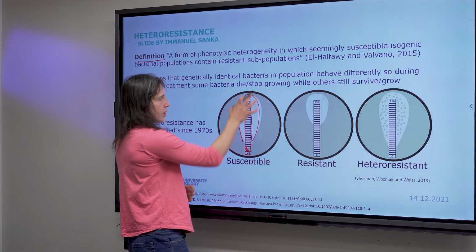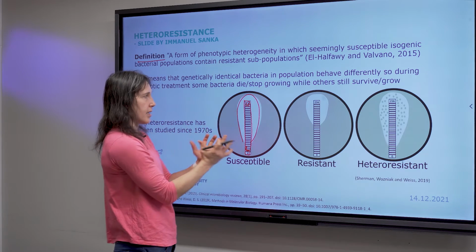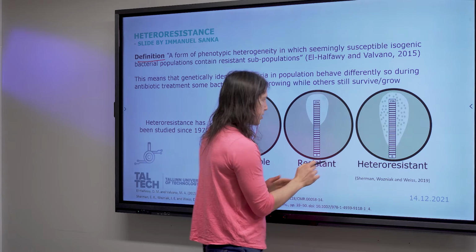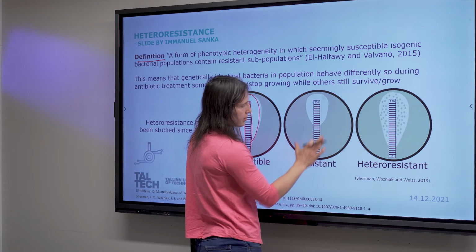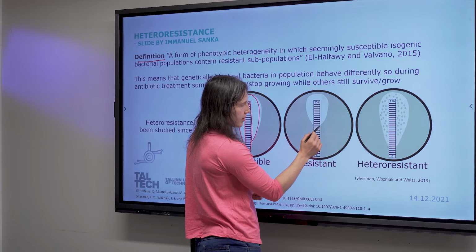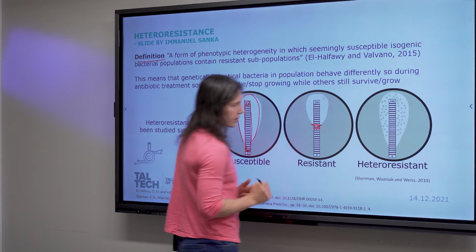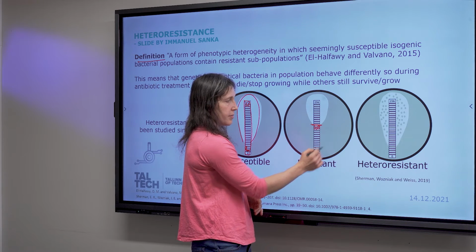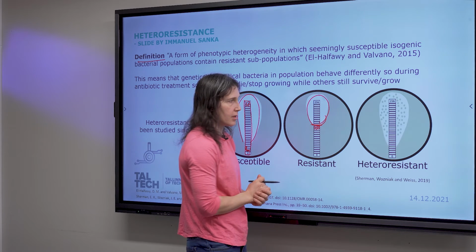The higher the concentration of antibiotic, the bigger the non-growth area you get. At a certain point, you can find the resistance from here until here. Let's say this was 100. From here, they are actually resistant because they are growing, and only very high concentrations can kill them.